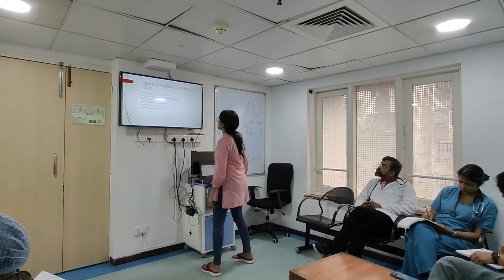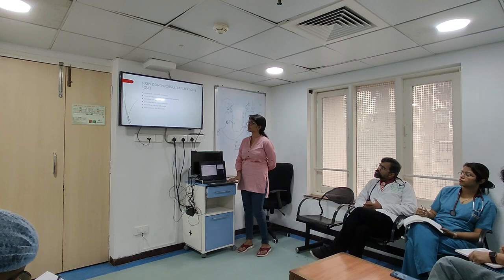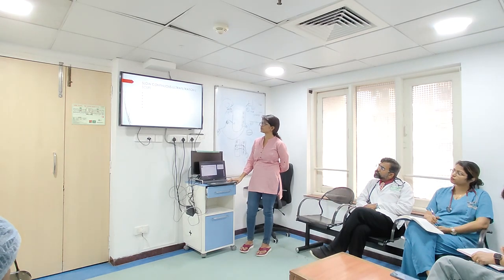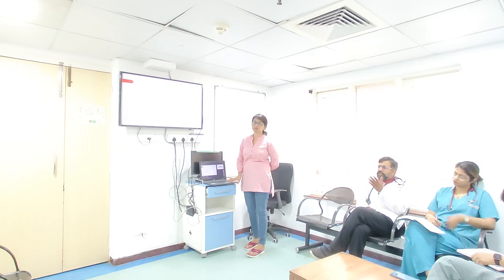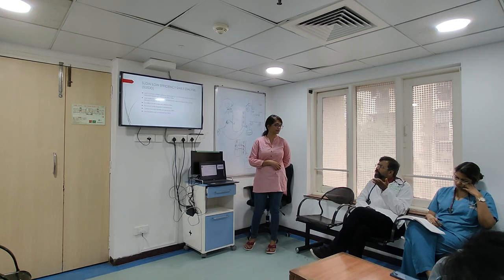So, slow continuous ultrafiltration. As we have discussed this before, it is used for volume control in overloaded patients. It removes solvent only. Blood flow is around 50 to 200 ml per minute. Fluid removal is 300 to 500 ml per hour. Then for SCUF, do you need a CRRT machine? You don't need it. You can just use your hemodialysis machine and attach it.